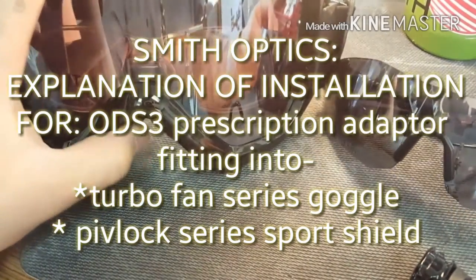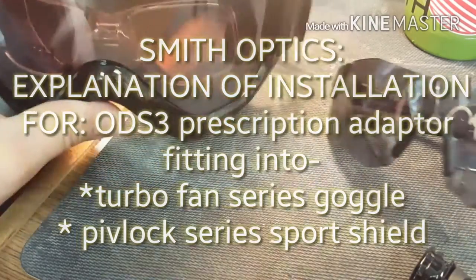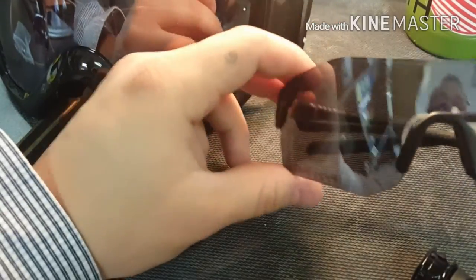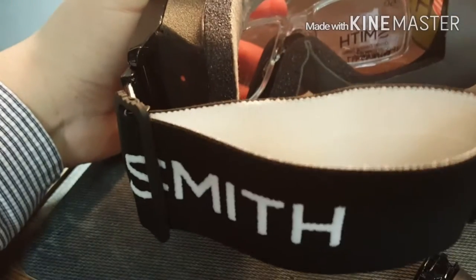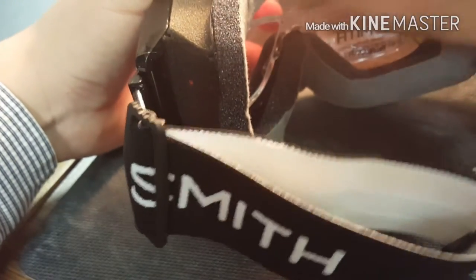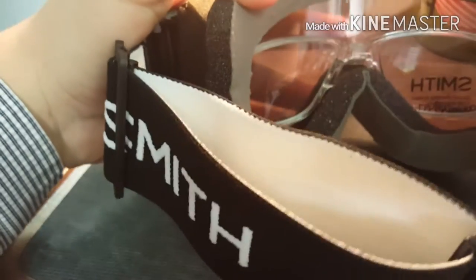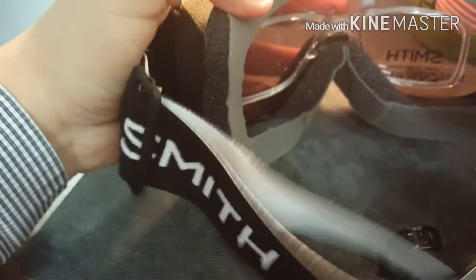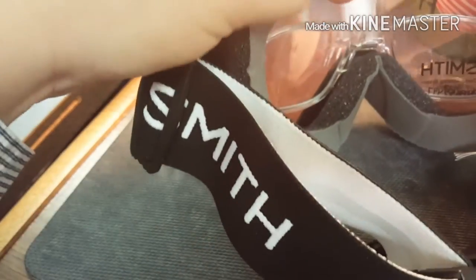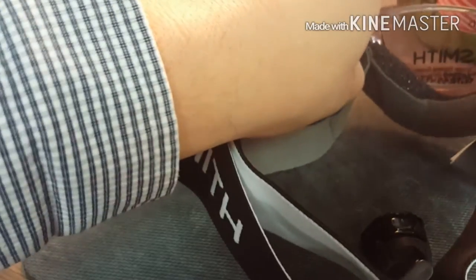In this video we're going to be talking about the ODS 3 adapter and the Smith Pivlock Arena with the snow goggle and the insert. This is for one of our patients at Colorado Eye Center. We're having troubles with the adapter coming out of the goggle, so we're going to do some close-up shots to show how that adapts, and then switch to the Pivlock Arena to show how that adapts with a different adapter.